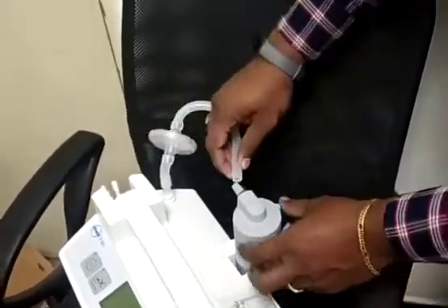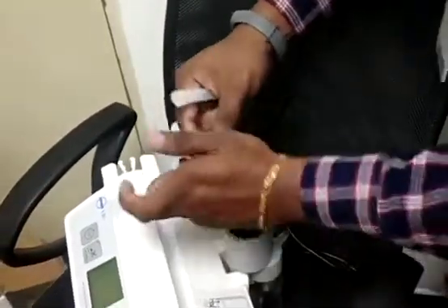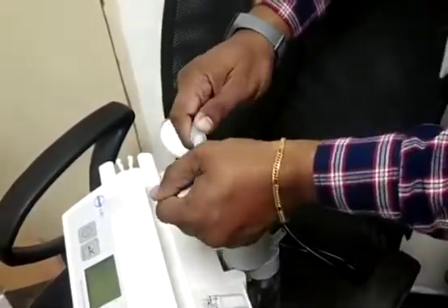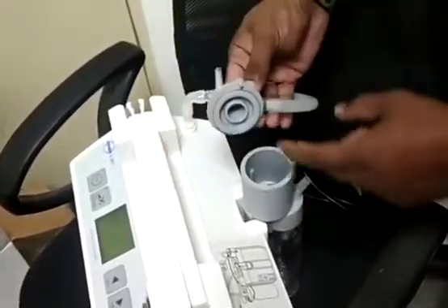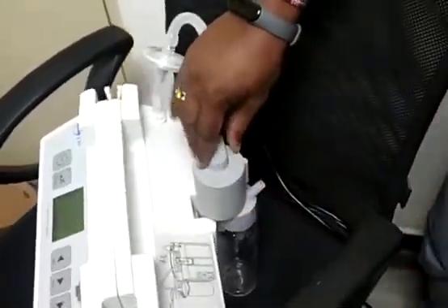Then connect this tube here. See the connections — it has to be fixed firmly here. You can connect it like this; take the cap out and fix the tube inside. Same way, you have to match this board, then press it — it will get locked.